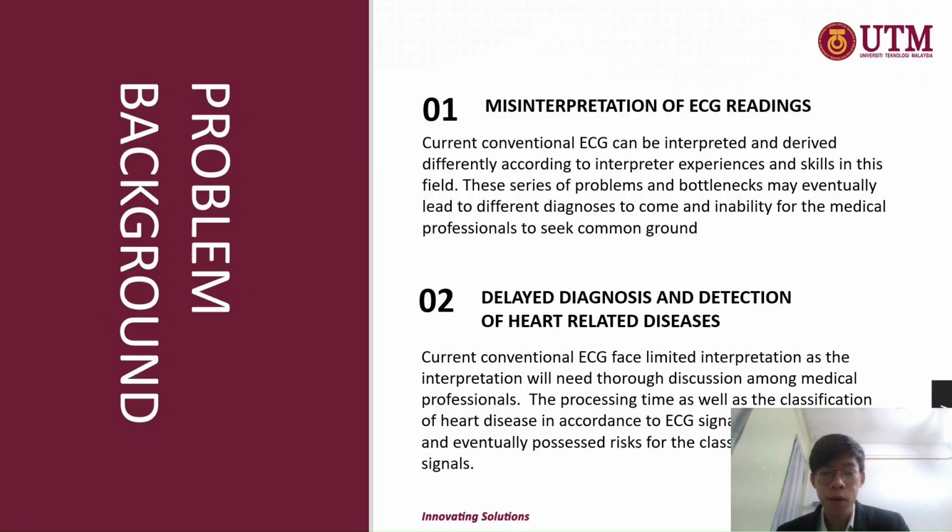First, the problem background for this final year project 1 is the misinterpretation of ECG readings. The current conventional ECG is universal; however, it can be interpreted and derived differently in accordance with the interpreter's experience and skill in this field. This series of problems and bottlenecks may eventually cause medical professionals to be unable to come to a common ground and to a standardized diagnosis for that specific patient.